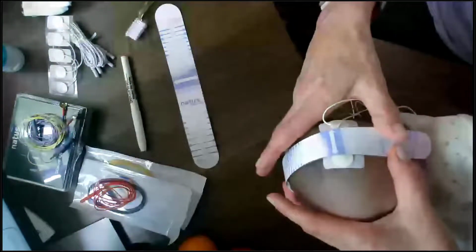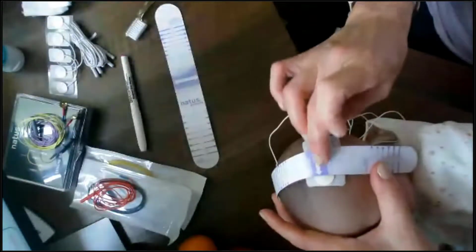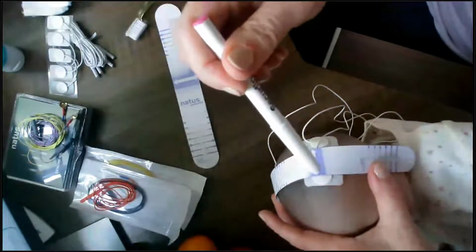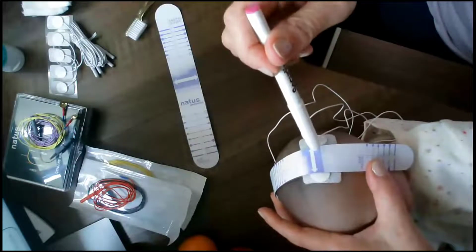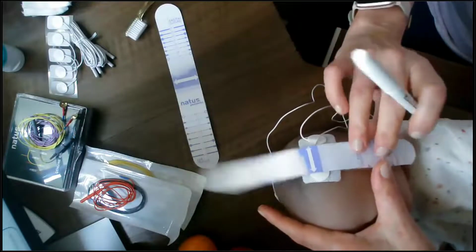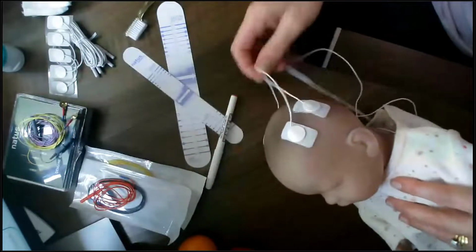And hopefully, you can see the arrow either side. I would take my surgical marker and mark the arrow on either side, and that is exactly where I'm going to place my electrodes. And you can clearly see that I actually have got my electrodes in that position.